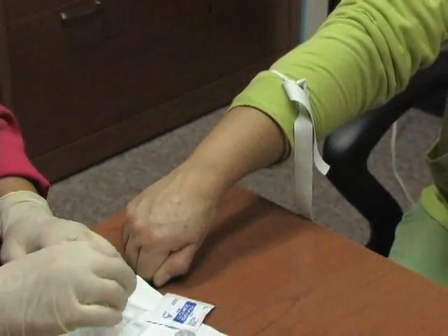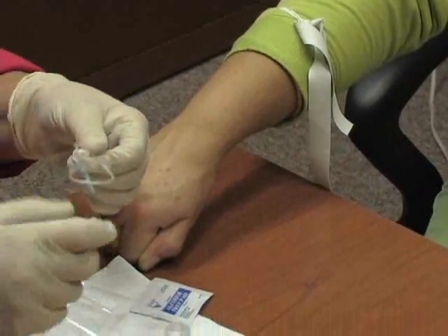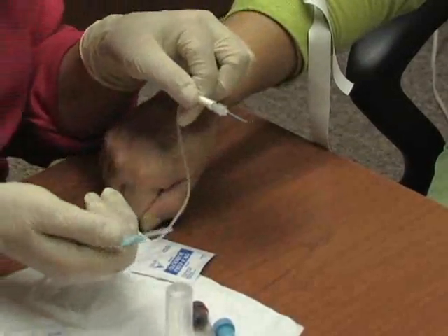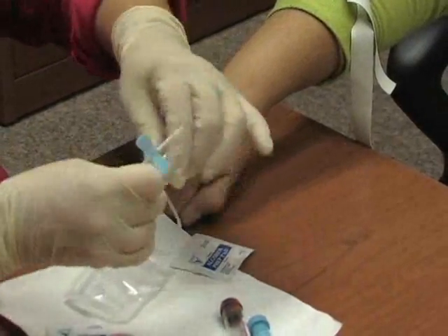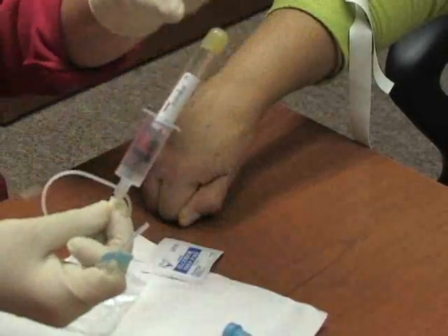I've prepared everything I need here. I'm going to draw with a butterfly, so I've got my butterfly needle. When you open this up, both of your ends have needles and they're both capped, so you'll be concerned about contaminating those. You have this vacutainer holder and you screw your needle into here. Get your tube ready to go — don't push it on, just have it ready.